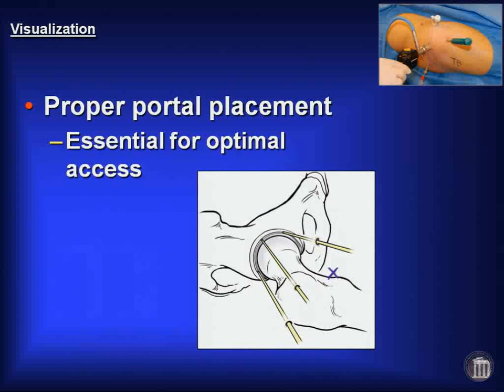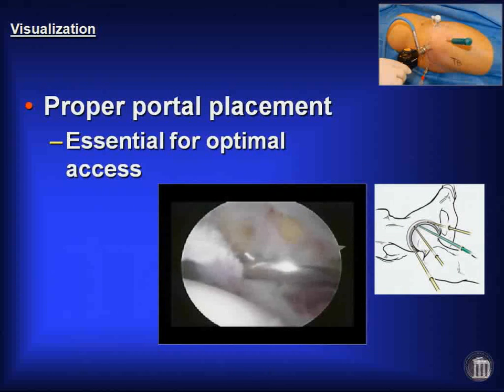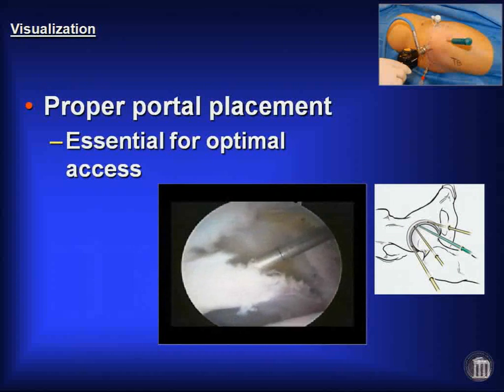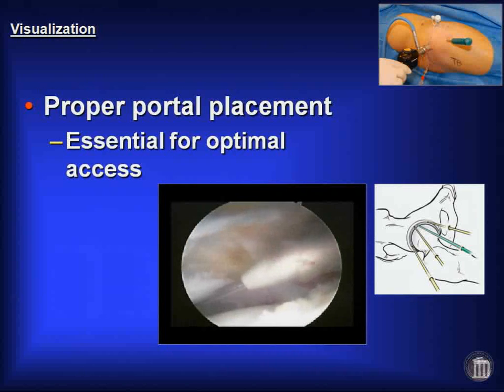We'll use supplementary distal portals for labral repair. I don't use the distal portal as a substitute for my standard portals because it compromises your access to the joint. Here we're burring the acetabulum from the anterior portal, and there's a variety of instrumentation systems available now where you can even place your anchor systems percutaneously. You don't even have to make a separate portal.